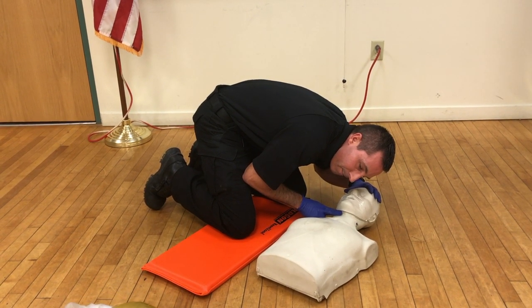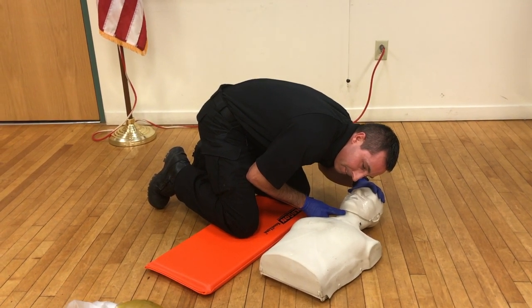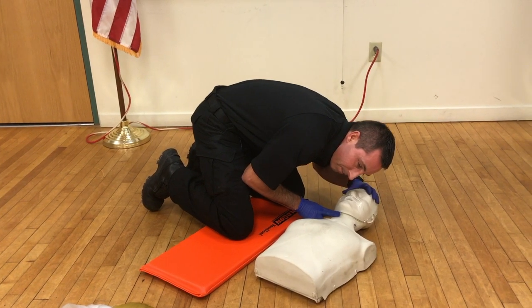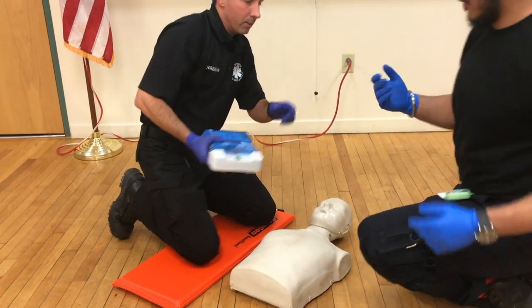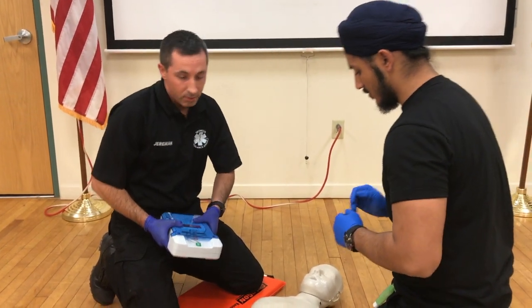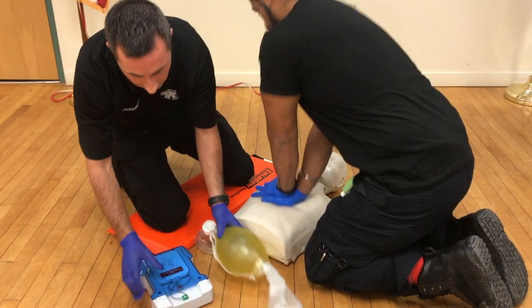Your patient's condition does not change and your second rescuer arrives with the AED. So once my AED arrives, I'm going to direct my second rescuer to begin CPR — 30 compressions followed by two breaths.